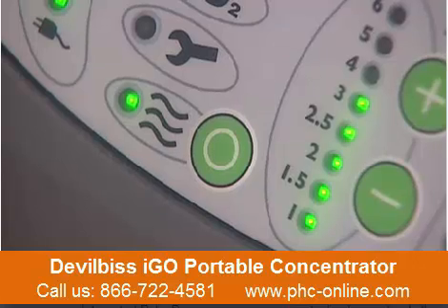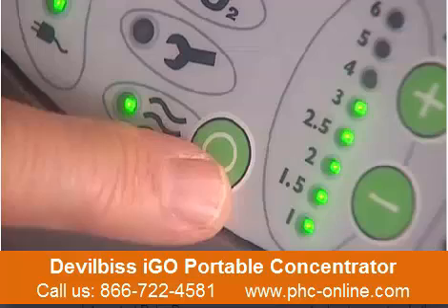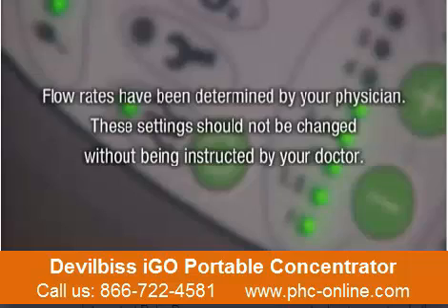The Mode Select button lets you choose either pulse dose or continuous oxygen flow. The flow indicator light to the left pulses with every breath in the pulse dose mode and illuminates without interruption in the continuous flow mode. Flow rates for both pulse dose and continuous flow have been determined by your physician. These settings should not be changed without being instructed by your doctor.